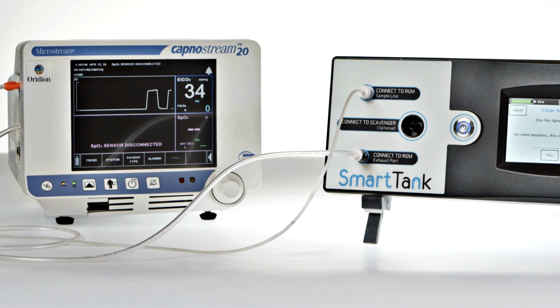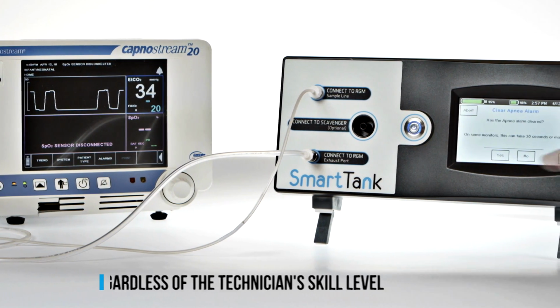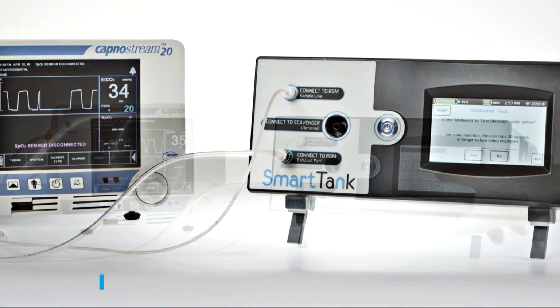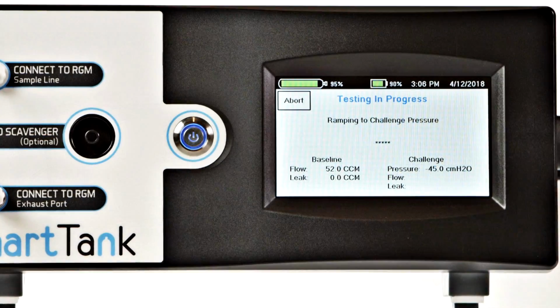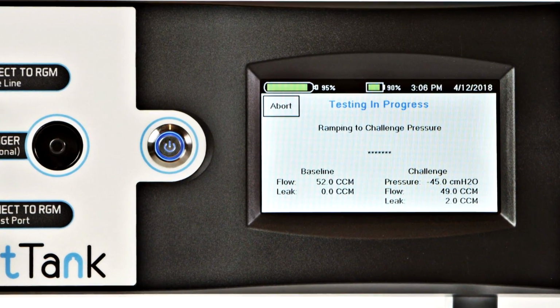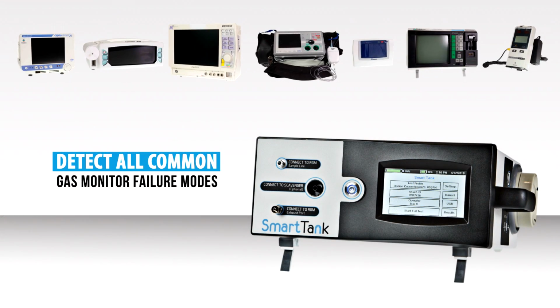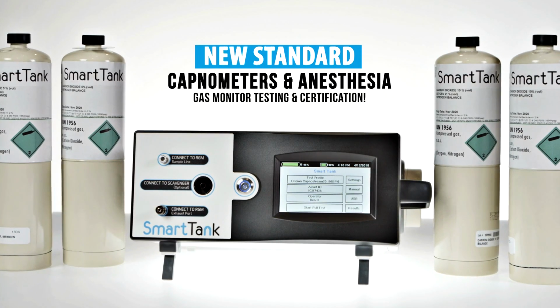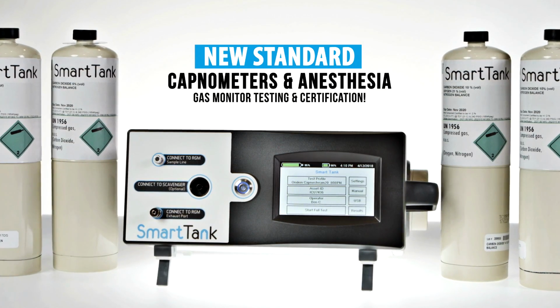For most gas monitors, this full test can be completed in under 4 minutes by any technician regardless of their skill level. And while fast and easy to use, the SmartTank still delivers superior testing which simulates real-world conditions and can detect all common gas monitor failure modes, even those missed by traditional testing methods. The SmartTank is the new standard in capnometer and anesthesia gas monitor testing and certification.